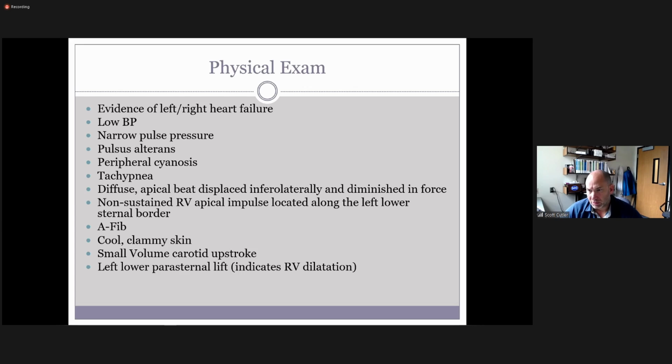I was talking to Tammy yesterday, and they were talking about a kid in the pediatric unit that they've been working with, and they used the strain imaging. She said that strain imaging is not like the auto recognition of the auto EF, where the system does the ejection fraction for you, which by the way is a thing. And by the way, our Sequoia does it, but I want you to still do it yourself.